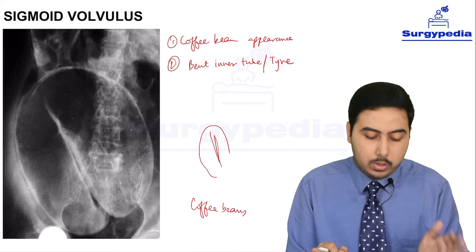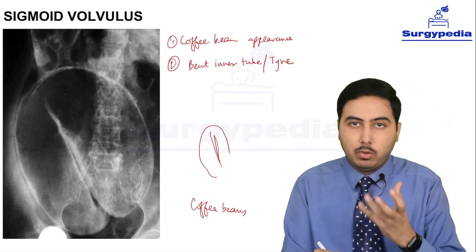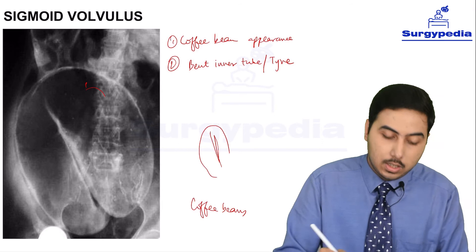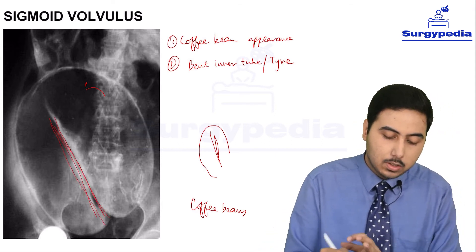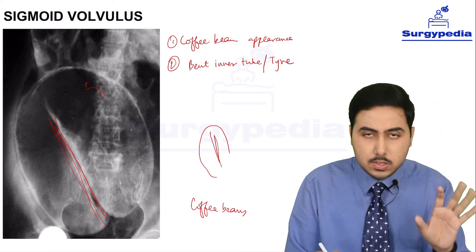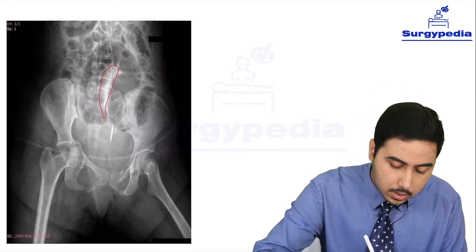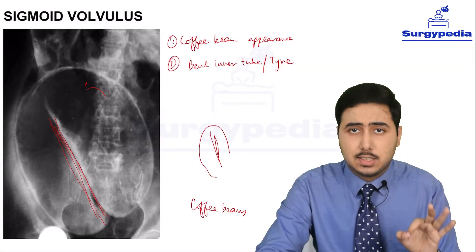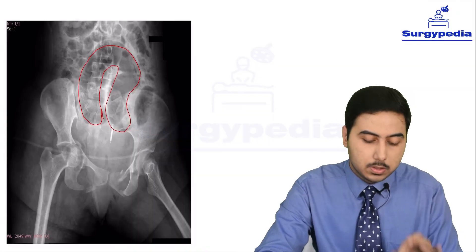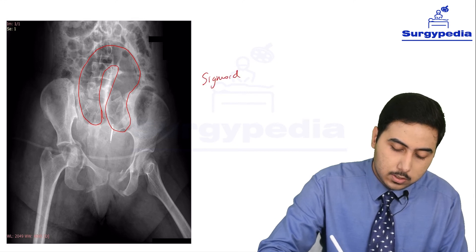Another thing to note in this image: the direction is like this. Sigmoid volvulus, when it rotates, it rotates in this direction - sort of in the anticlockwise direction. Just keep this in mind. Let us have another look at sigmoid volvulus. In this second image, you can also see the bent inner tube or coffee bean shape. This is also sigmoid volvulus, just like the previous classical image.